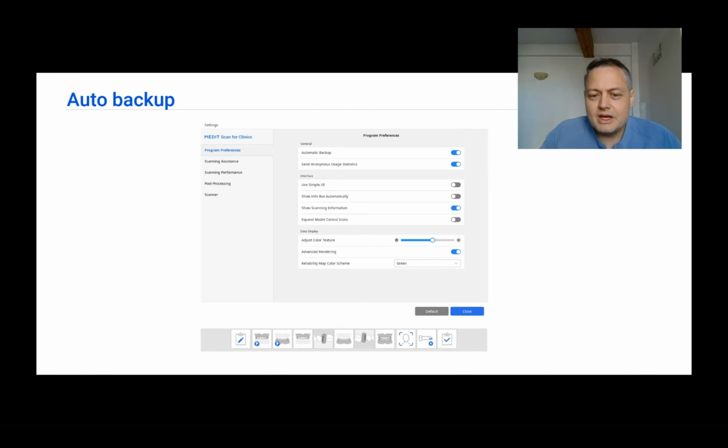To be even more safe, here is what I do when I scan a stage. For example, I had the pre-op and now I'm going to scan the op, and the op I'm going to scan piece by piece. For those who have this protocol, my suggestion is, after scanning a part of the operation stage, and before you do some preparations on the teeth and scan again, stop before you do anything.